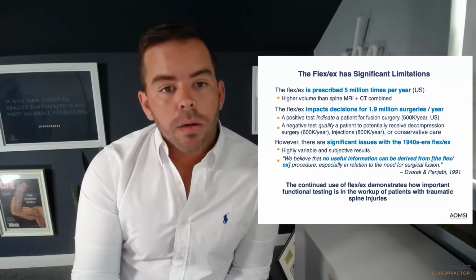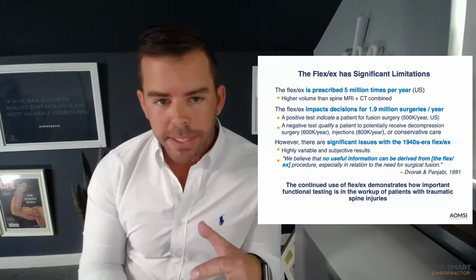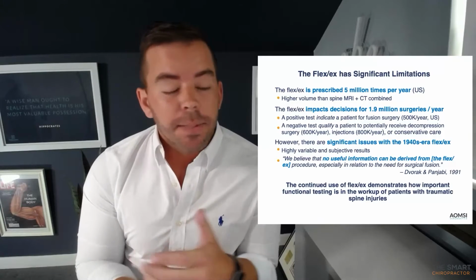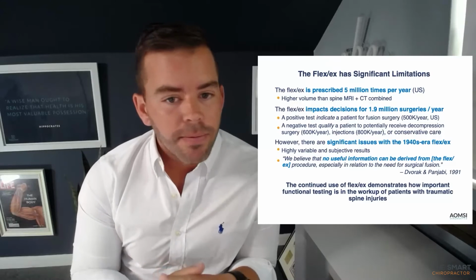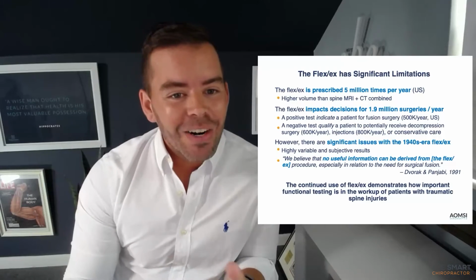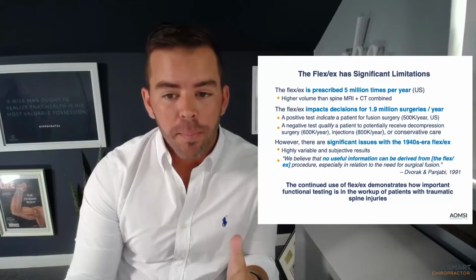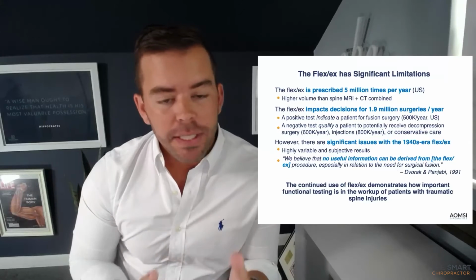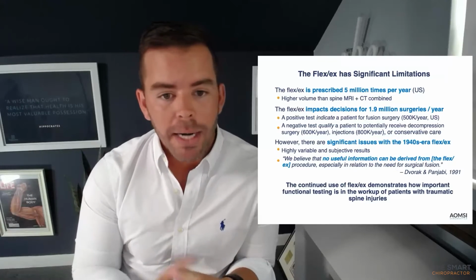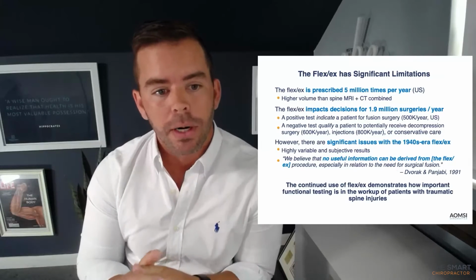So again, let's talk a little bit about the flexion extension. The flexion extension X-ray has significant limitations. So as we talk about, it's prescribed quite a bit. It's still the standard of care, prescribed about 5 million times per year. That's higher volume than a spine MRI or CT combined. So that's really remarkable considering the technology. The flexion extension still impacts a great amount of decisions. Again, we talk about surgeries here, 1.9 million surgeries per year.